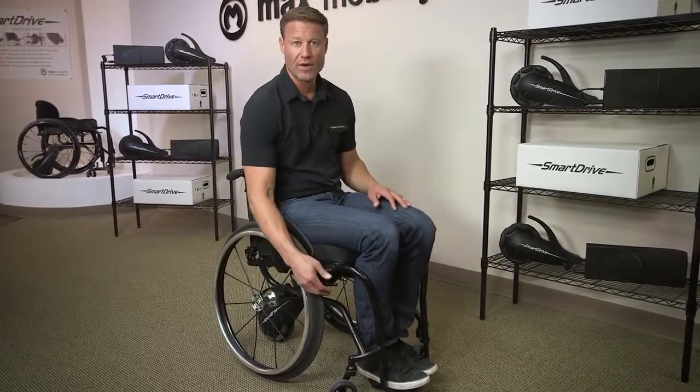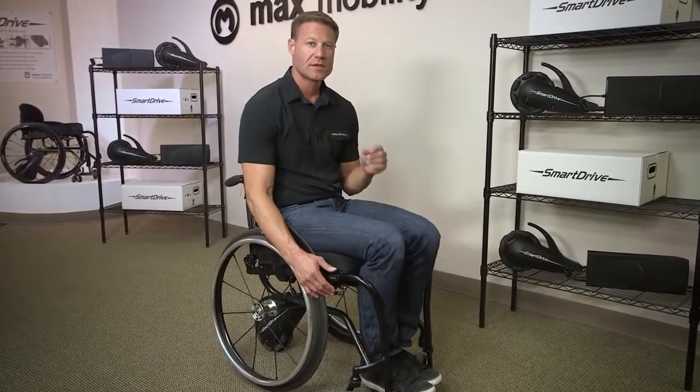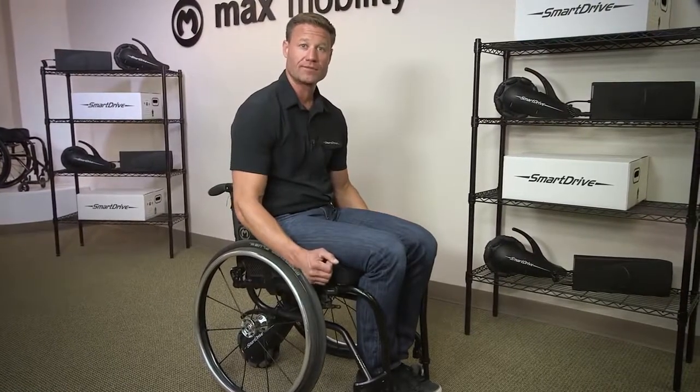We recommend this type of wheel lock because it doesn't compete for space with the SmartDrive buttons. Some wheel locks have upright handles and that can block access to the buttons. In that case, you may need to move the buttons forward so they're not blocked by the brake handle.